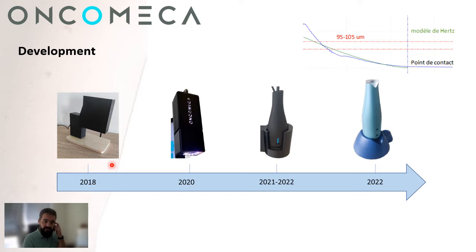For each device, we need to build another database to improve the robustness of the Oncomeca medical device. The strategy is to focus on the signal between the sensors inside it, and Oncomeca measures the stiffness of the skin by indentation, like that. The force is recorded at each micrometer, and we create, in fact, a force curve.